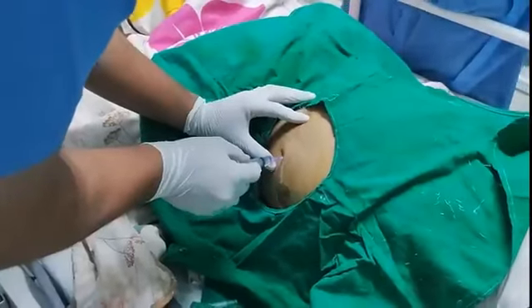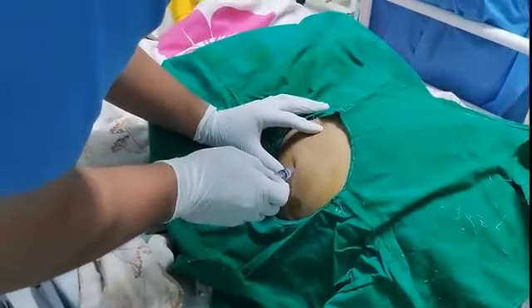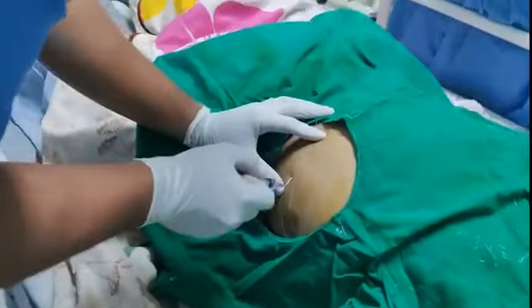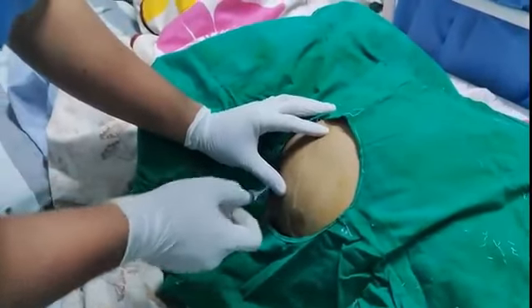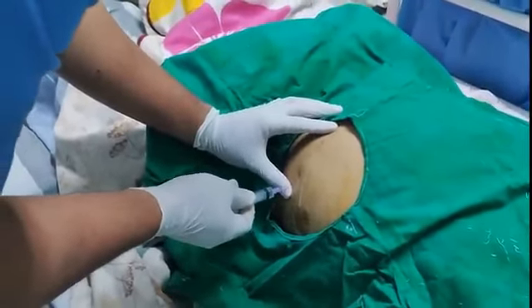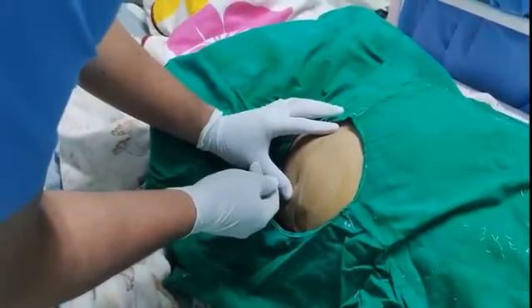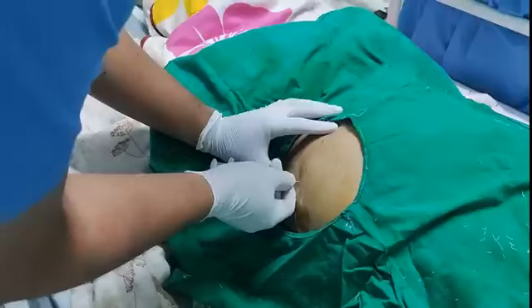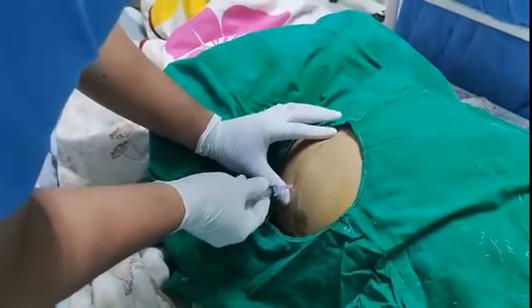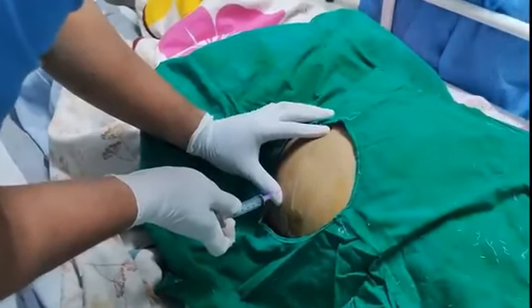To choose a needle insertion site, carefully percuss, because dullness to percussion confirms the presence of fluid. If needed, use ultrasound to identify a site, confirming the presence of ascitic fluid and the absence of overlying bowel. In selecting an insertion site, avoid surgical scars and visible veins. If available, mark the insertion site with a skin marking pen.